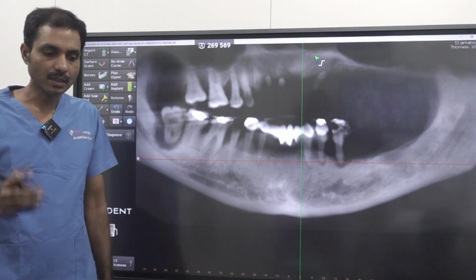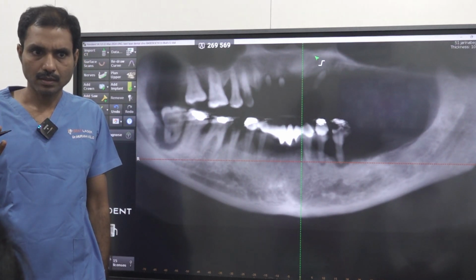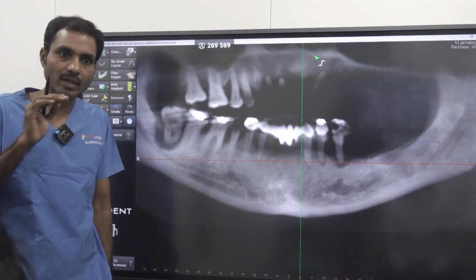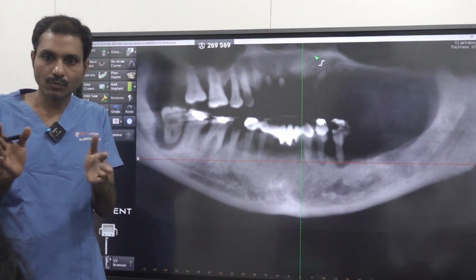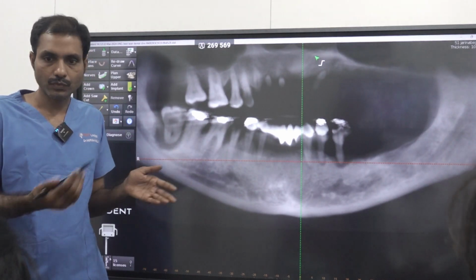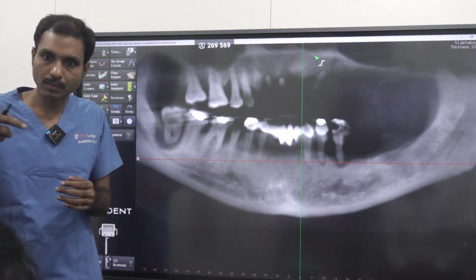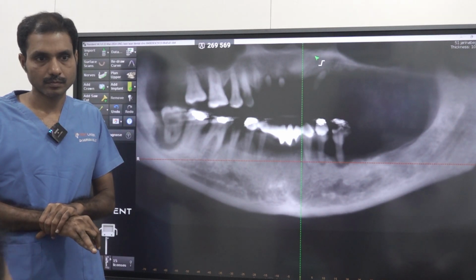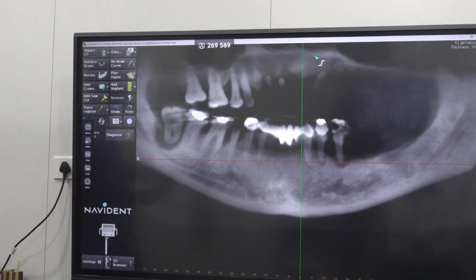See, the abutment can be changed. In conventional, the abutment position can be changed; 15 degree, 25 degree abutments are there. In single piece, you can bend the abutment. But surgically itself, make sure it is in a somewhat decent position. After that, you can correct the abutment position by changing 15 to 25 degrees, or if it is a single piece, you can bend it. After bending also, you can correct some more by abutment preparation, abutment trimming. Both basal and compression implants can be bent.